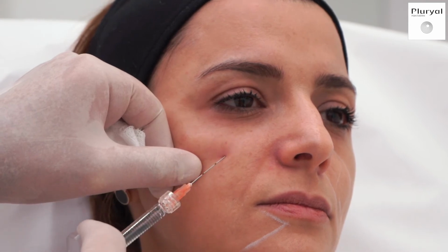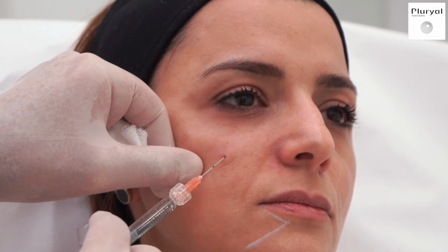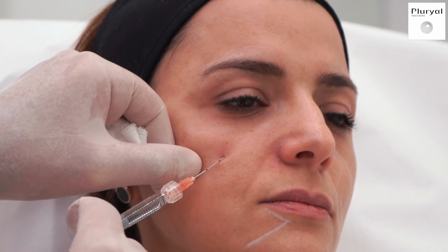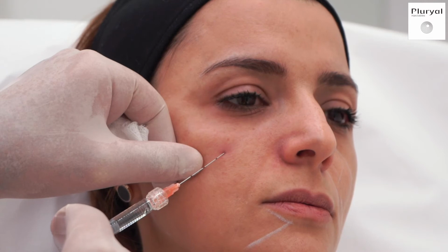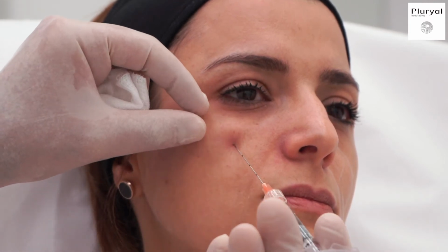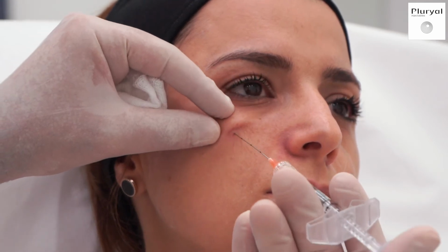Then I go deep to the bone. Then I go lateral, also to the bone.